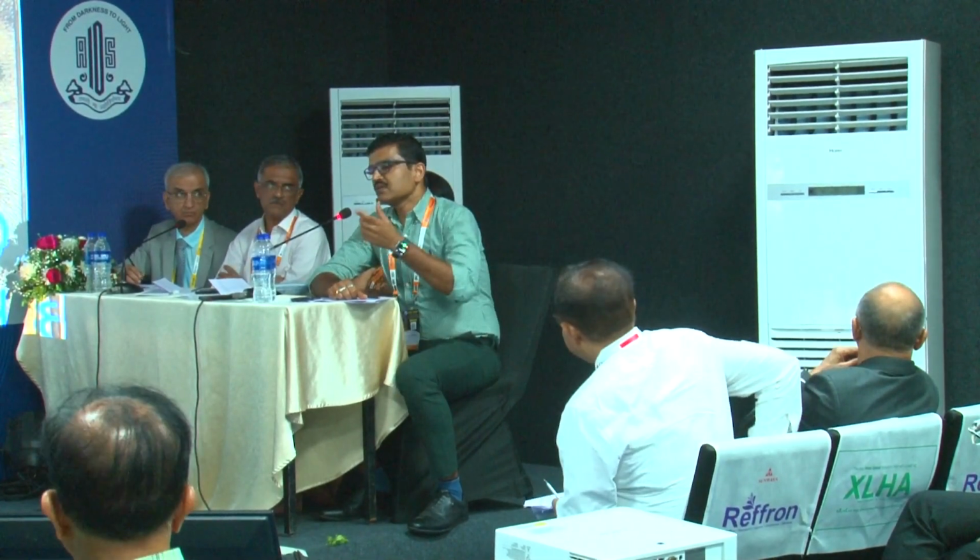I think not even the phaco needle would adjust to the AC depth, the largest and longest. Absolutely, I took 10 plus 8, almost 18 millimeters. So you have to go right to the neck of the handpiece just to ensure that the tip is reaching somewhere close to the posterior plate. Amazing. Even then, the obliquity would be so much that it would create a lot of corneal folds and maybe mar the visibility also. Very soft eye, very many folds.